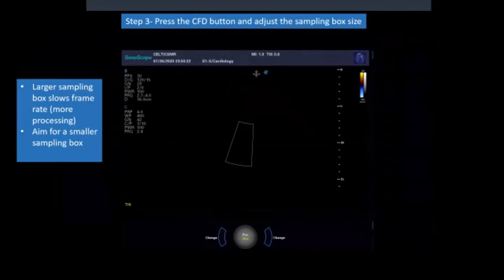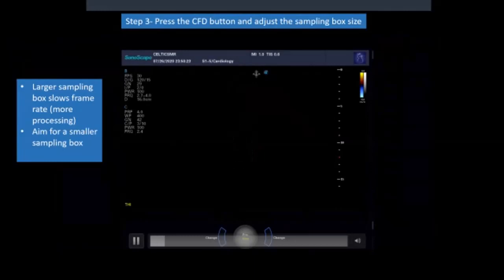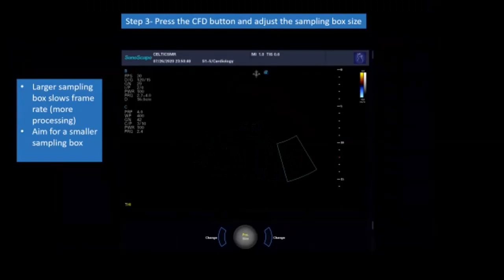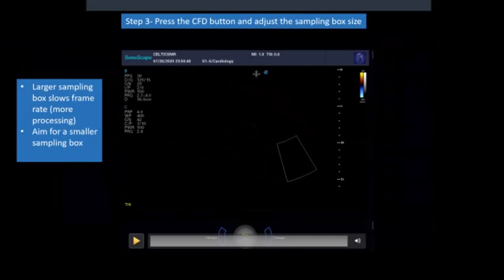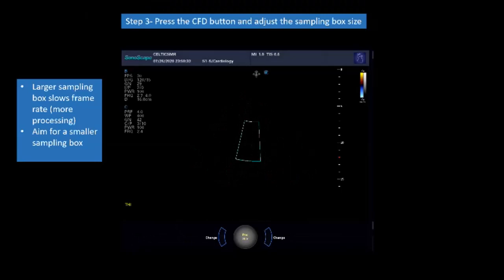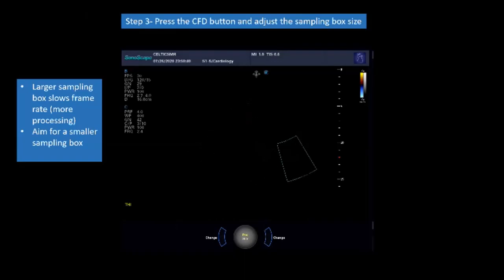The next step is to press the colour flow button, and you get the sampling box produced. You want to change or alter the size of the sampling box — don't make it too big, because that slows the frame rate. You want it to be a nice size to get all the information you need. You can also move your sampling box into the area you're interested in sampling. If I'm doing a hunt for a murmur, I might move the colour box around to look for the most obvious areas where we'd expect to have a shunt or regurgitation.